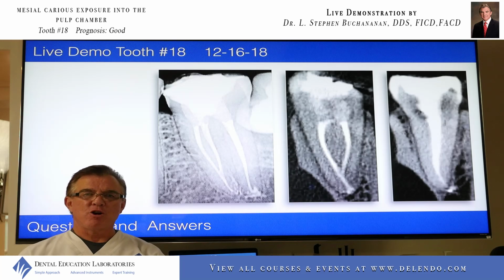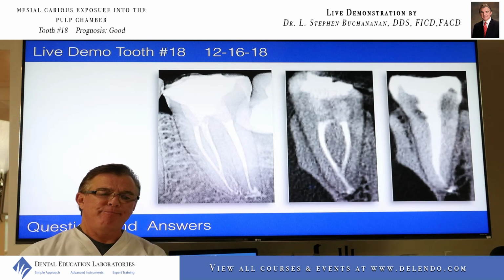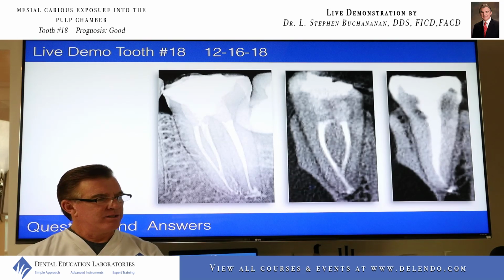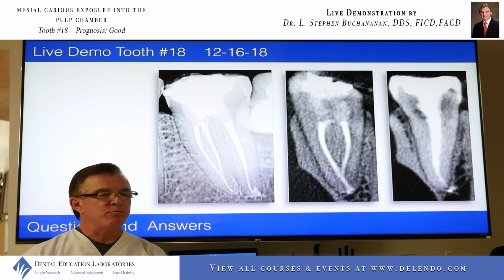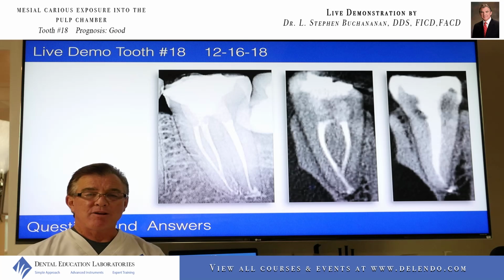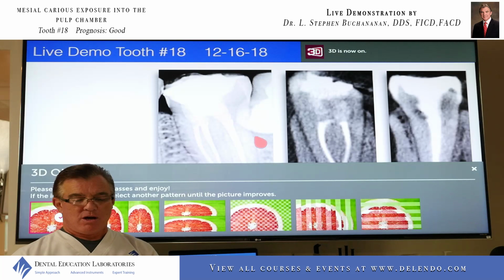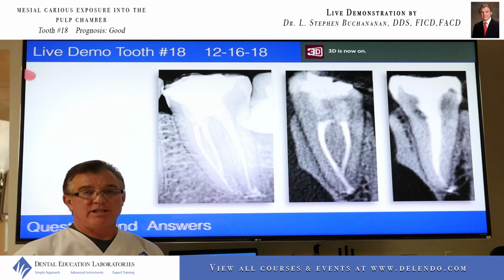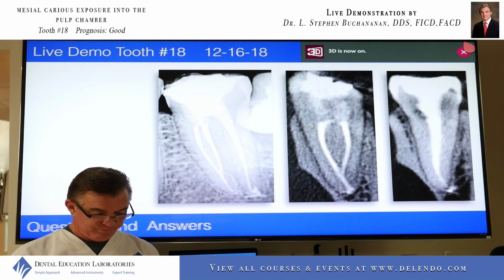I've always been a big fan of cone beam CT. If anything, in the last 5 years, I use it more often. I don't think 5 years ago I was doing all my post-ops and recalls with that. What else has changed? I'm doing heads-up magnification. I don't put my eyes in oculars anymore. Having a set of 3D glasses, little slim polarizing lenses on while I just look up at the screen and do my procedures is totally changing my experience in dental practice. I think it's going to extend my career by years.